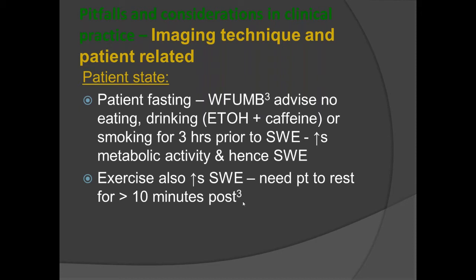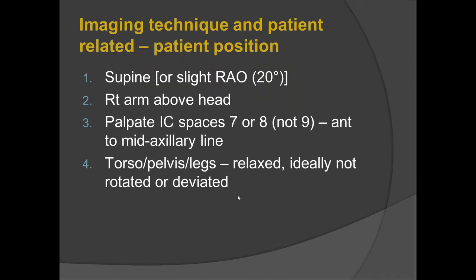I have to say in our patient group there aren't too many of them coming in active wear, so that's not a consideration for us, but the World Federation for Ultrasound in Medicine and Biology have done studies that show you need to have a good 10 to 20 minute rest before you do a shear wave.